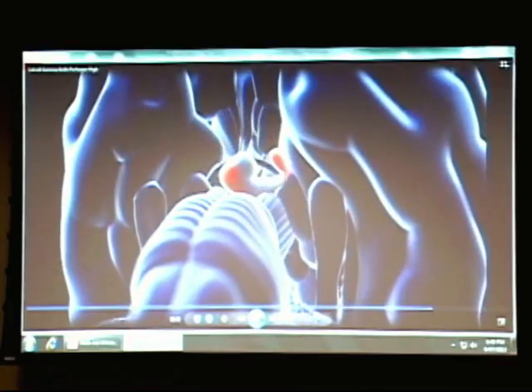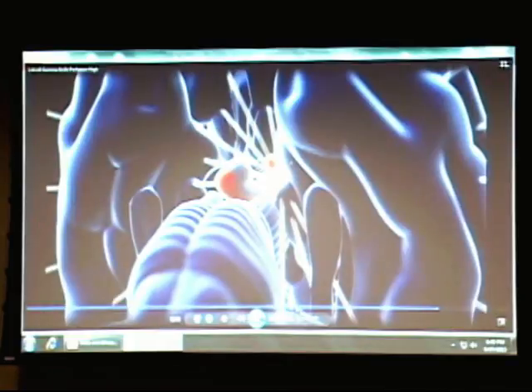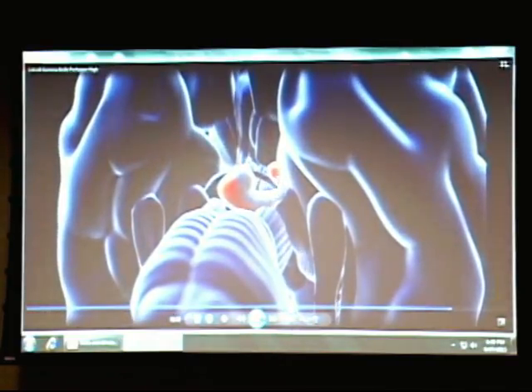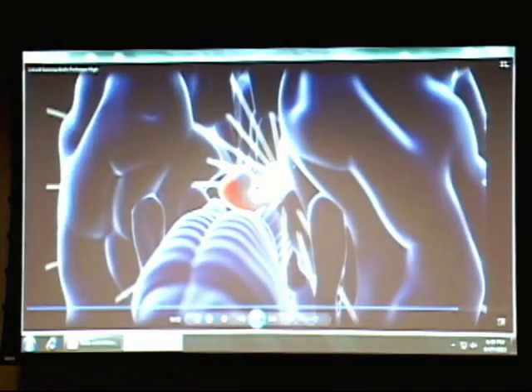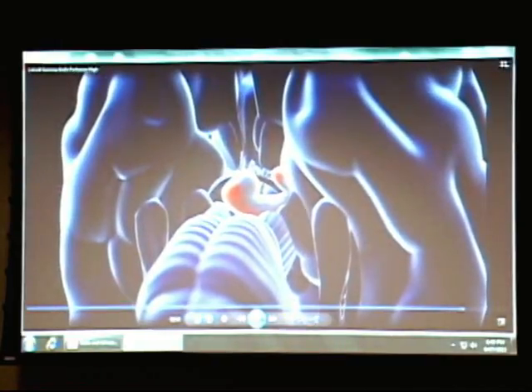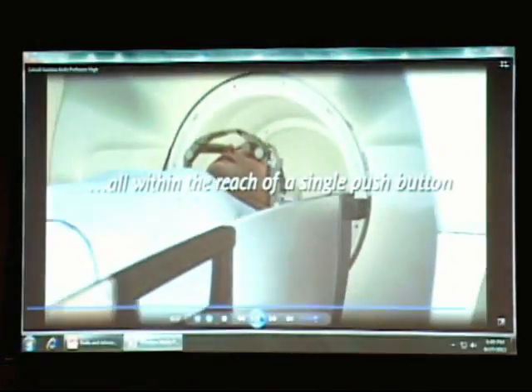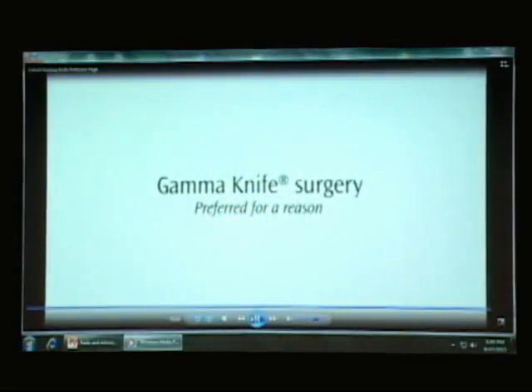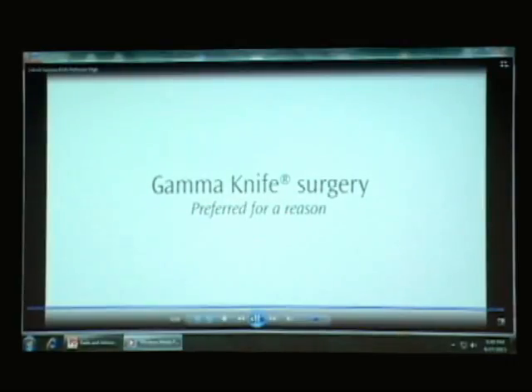So you can see we do different sculpted shots to treat each of these individual bits of the tumor. So you can have multiple targets, and due to the fact that it's so automated, the time between the different shots is in seconds, compared to what we would have before, which was in minutes. So the speed and the precision is tremendously different. That gives you an idea of what that new machine is doing. Let me cut it off, but it wants to do it again.